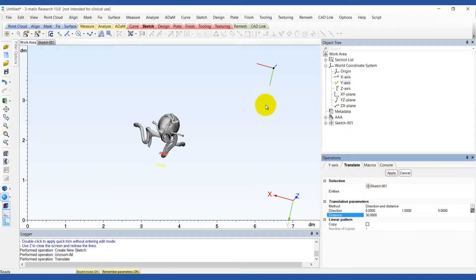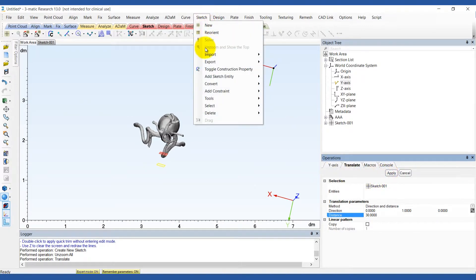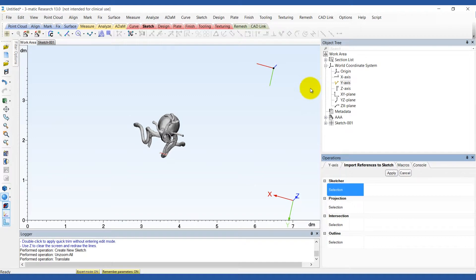Before you start drawing the base profile import the outline of the aorta into the sketch to use as a guide.